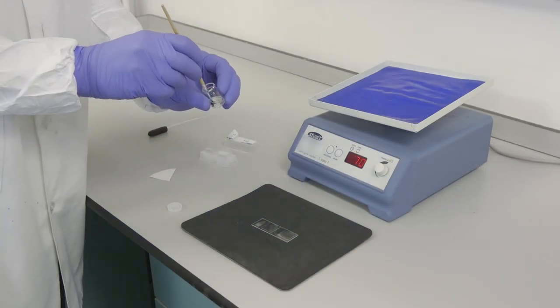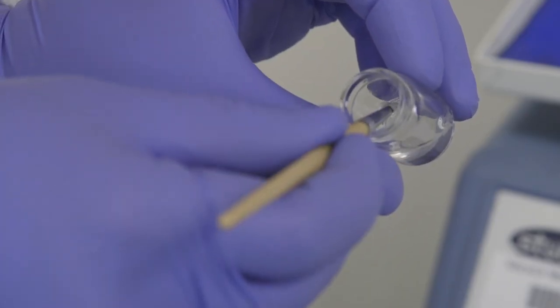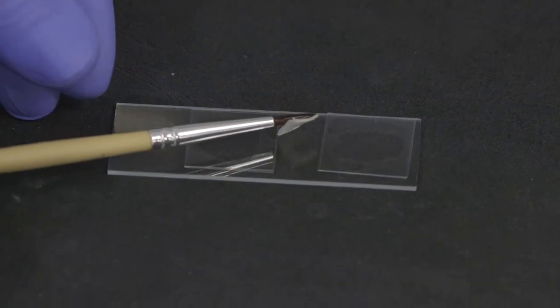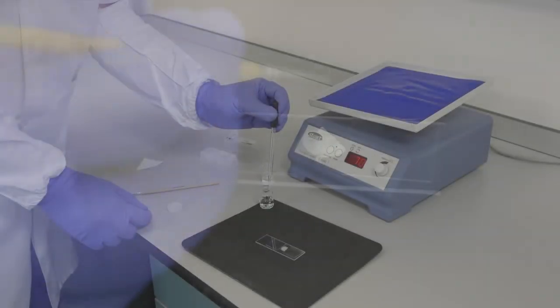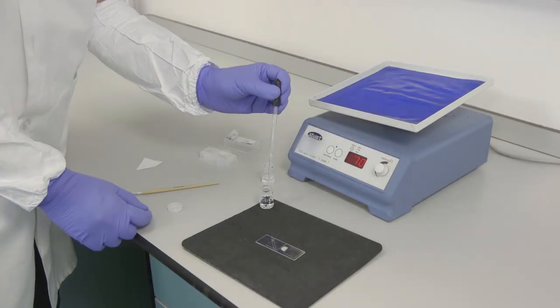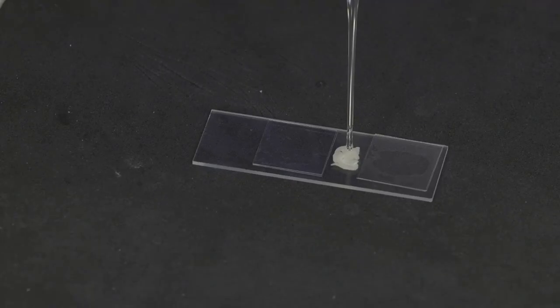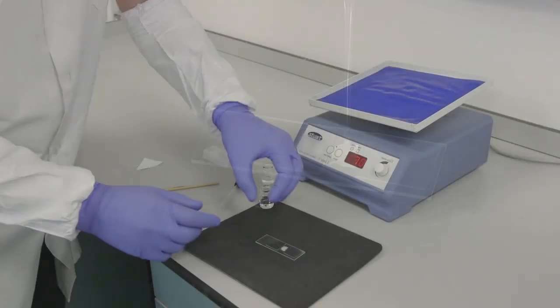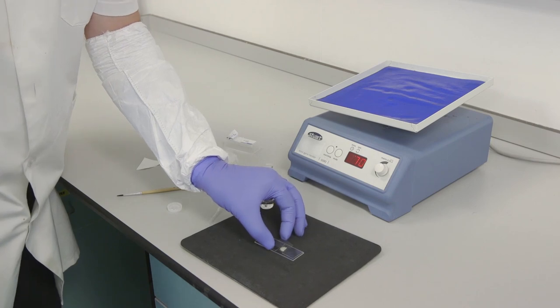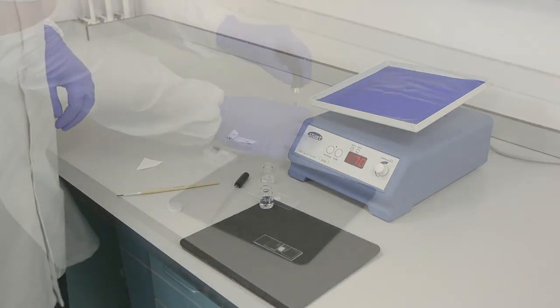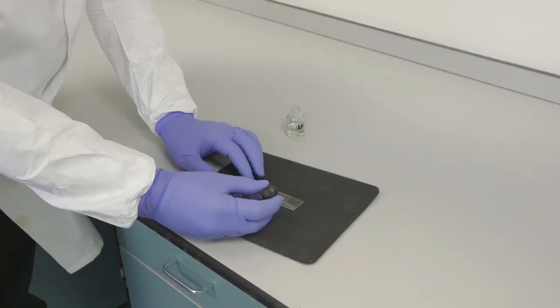Carefully place the slice right side up on the slide and position it with a small brush. Apply the mounting media and coverslip. Use clear nail polish to seal the coverslip.